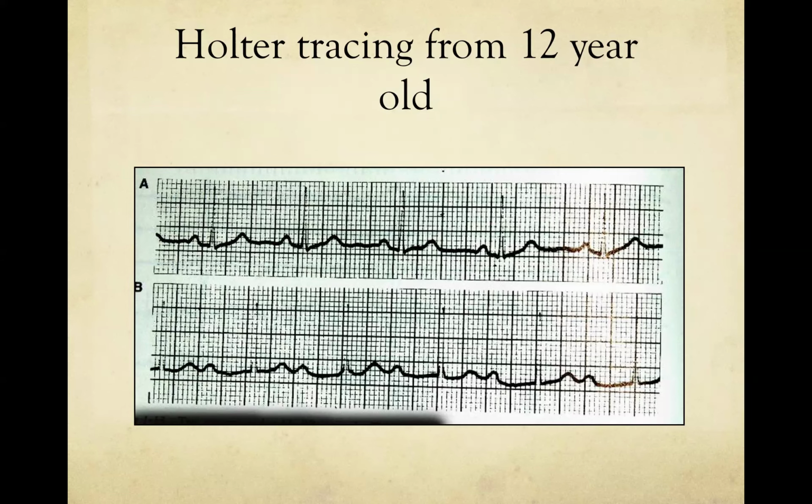They could be having, maybe they had a big meal just before they went to bed, and they're having a little reflux, stimulating their GE junction a little bit. It's not inconceivable. I would say this PR is especially long, but that's absolutely right. Get 100% credit for that answer. Any other possibilities? That is probably the most likely reason.